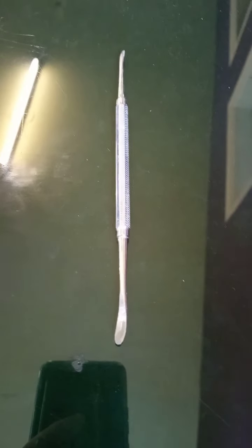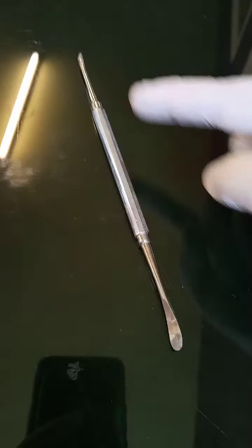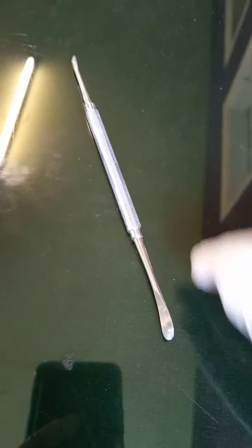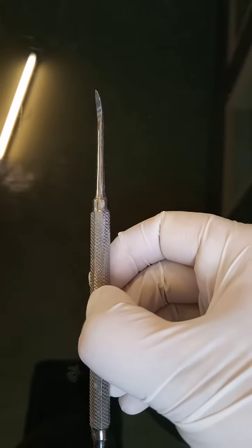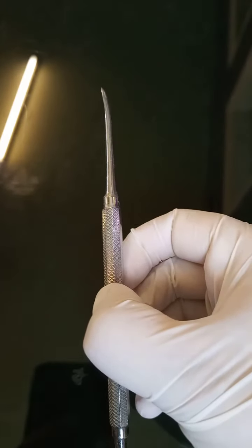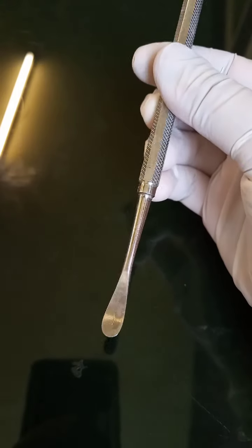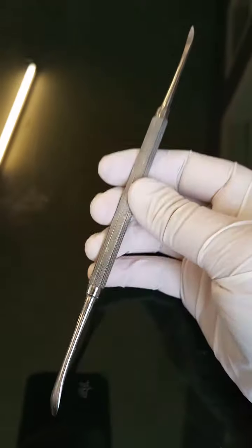This is periosteal elevator, also known as Molt elevator. It is a dual-ended instrument having a sharp pointed end and a rounded broad end. The concave surface of the sharp pointed end is used to release dental papilla around the teeth by using a prying motion, while the rounded broad end is used to reflect a full thickness mucoperiosteal flap.